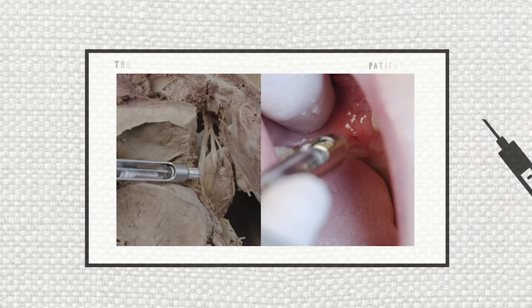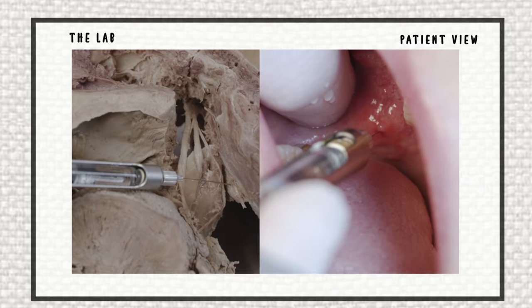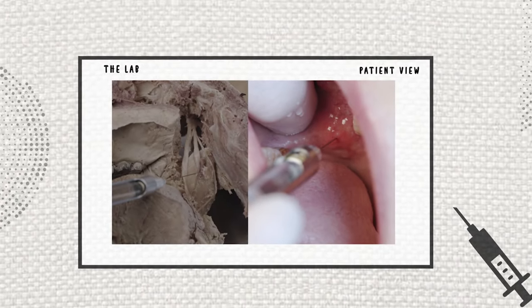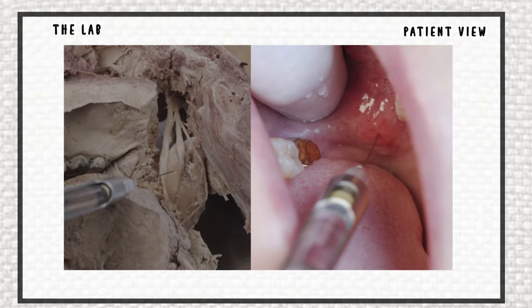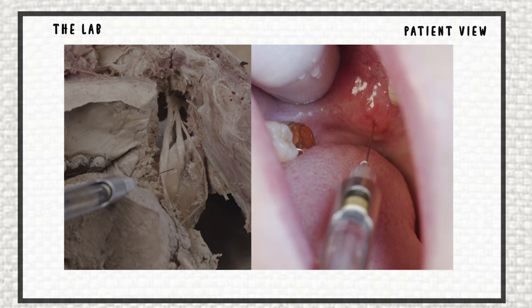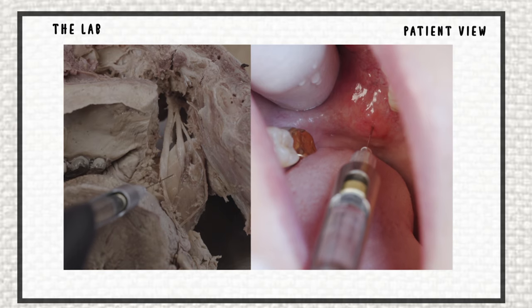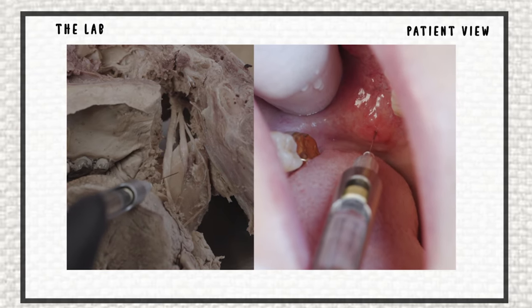If your needle penetrates too deeply without contacting bone, you're now too far posterior. Your needle may be near some very important anatomical structures you do not want to inject into. The tip of your needle may be within the parotid gland, near the facial nerve. If you inject here, you can cause transient facial paralysis. In this case, withdraw the needle slightly until one-quarter of the needle remains in tissue, and reposition the needle and the barrel of the syringe towards the back of the mouth, over the mandibular molars. Now advance the needle until you contact bone, and finish the injection.